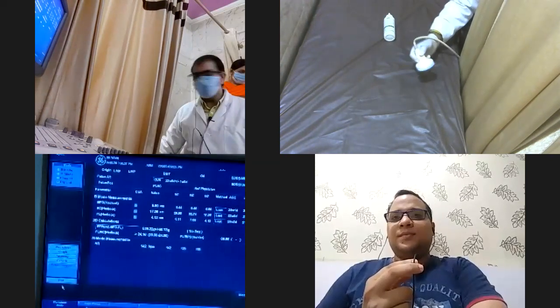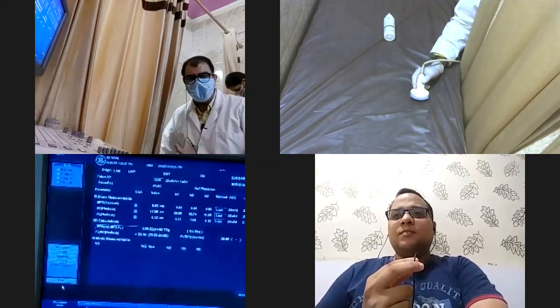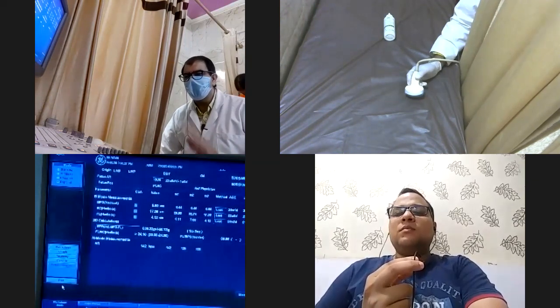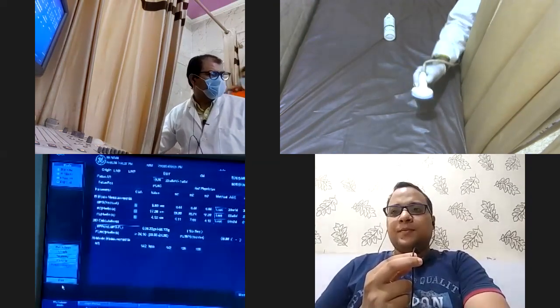Now, what we will do, we will not take theory here because the theoretical classes are already sent to you. I will show you how the screen orientation is practically, how to implement your theory on patients. That's all. First of all, this is the probe. You can see the probe over here.